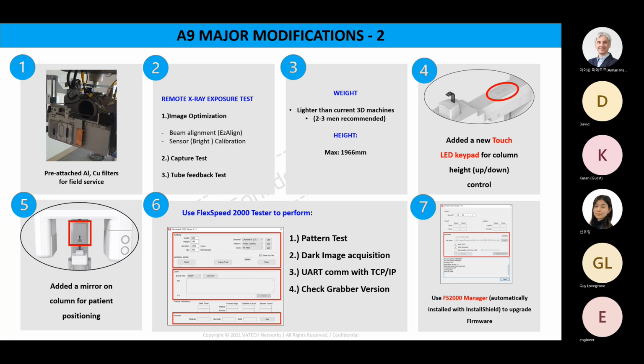And another point in this device is that we added a mirror.